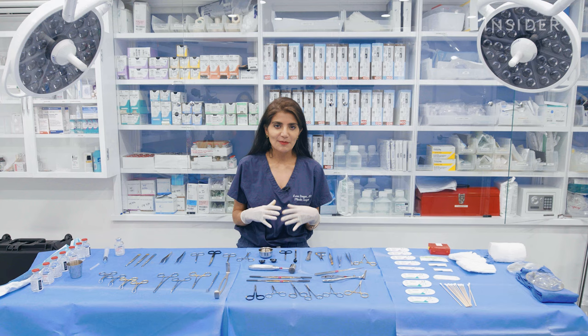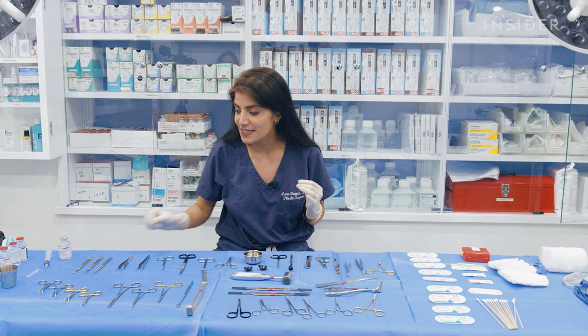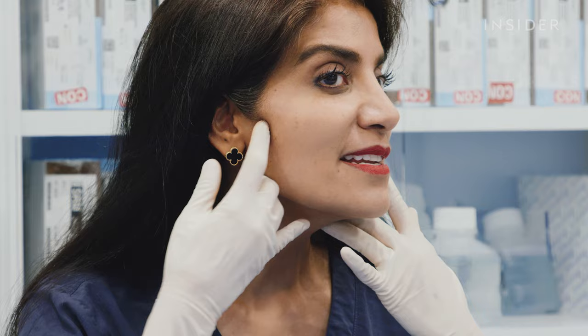My favorite and most frequently performed operation is the facelift. I like to use an 11 blade for a facelift because it's a super precise operation. So I'll start by making a curvilinear incision hidden inside the ear and curving behind the back of the ear, and a little one underneath the chin. And I use those incisions in order to dissect the deep plane of the face, free from the soft tissue of the face and the neck.